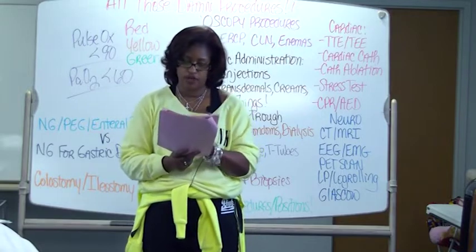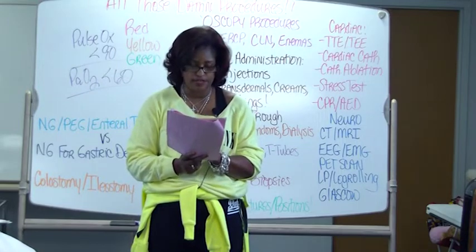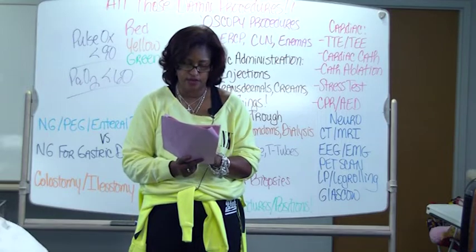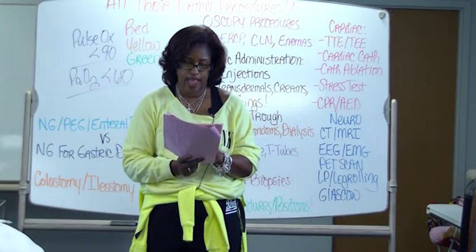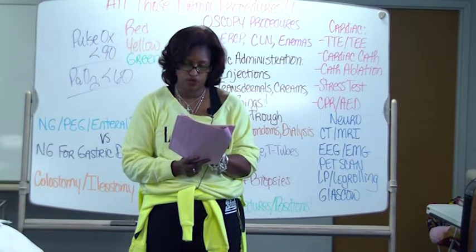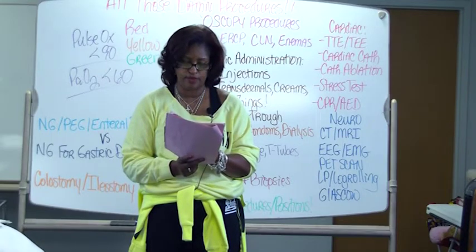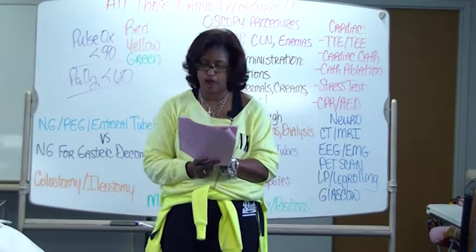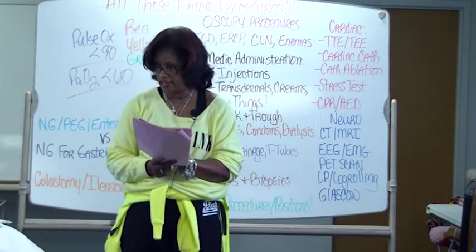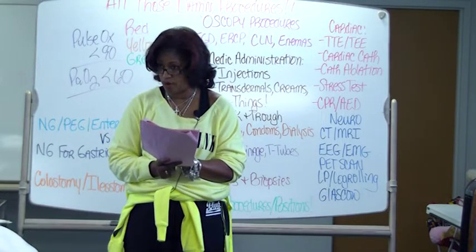The paragraph under it is huge. Very big deal. It already says, the first thing you do is make sure the order is okay. Okay, yeah. Then it says, if a reaction could occur, stop the feeding 1 to 2 hours before you give the medicine, then wait the same amount of time before you resume the feeding. Let me tell you why that's there. Your patient has medications that need to be taken on an empty stomach. This is there for that purpose.